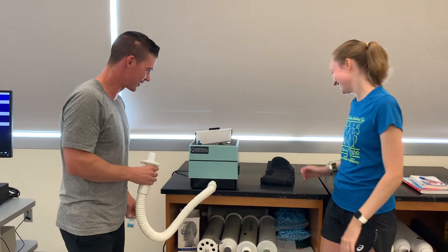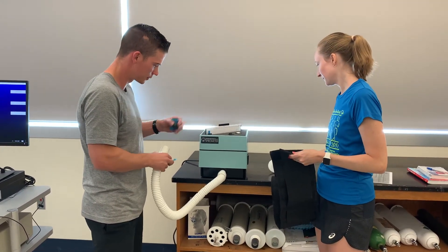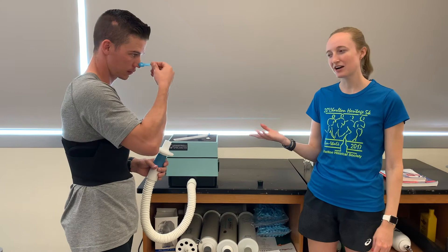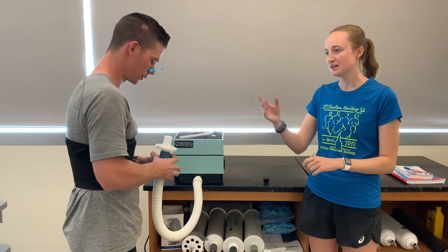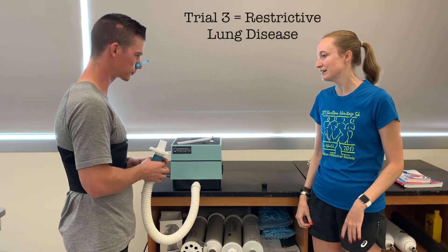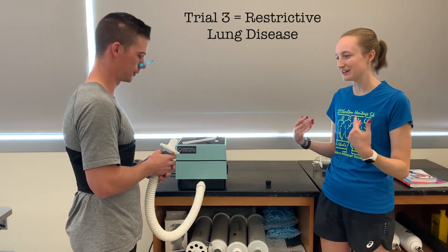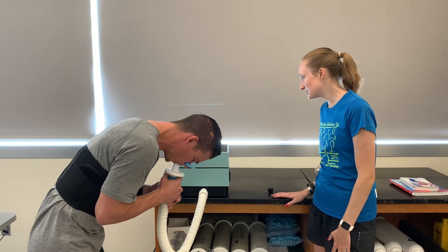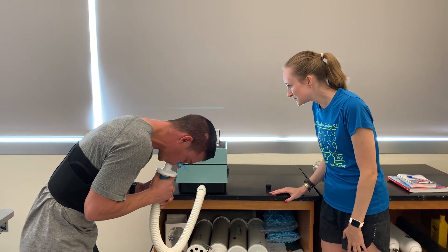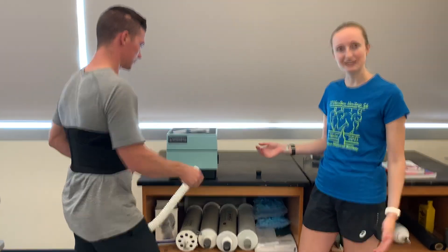Okay, so now for trial two we have the rubber stopper in, simulating obstructive lung disease. Same exact maneuver — fill those lungs all the way up, go on that mouthpiece, blast it all out. Nice job, keep going, push — and you're good. For trial three, we put the wrap on to simulate restrictive lung disease, compressing his lungs a little bit. Same maneuver — blast it out, keep pushing, keep going — and you're good. Nice work. That's what we did on the box spirometer.